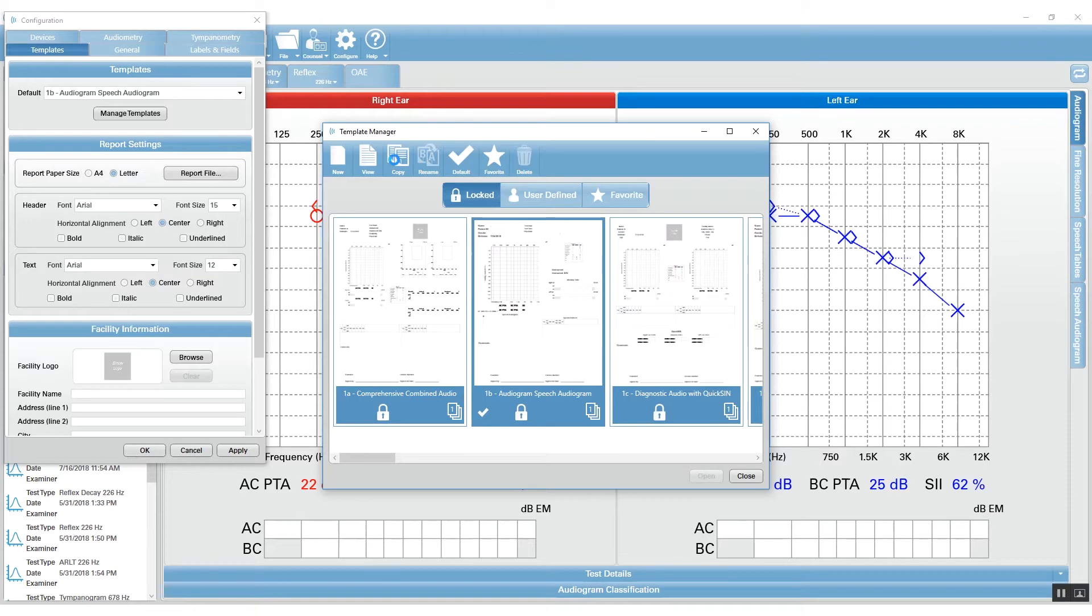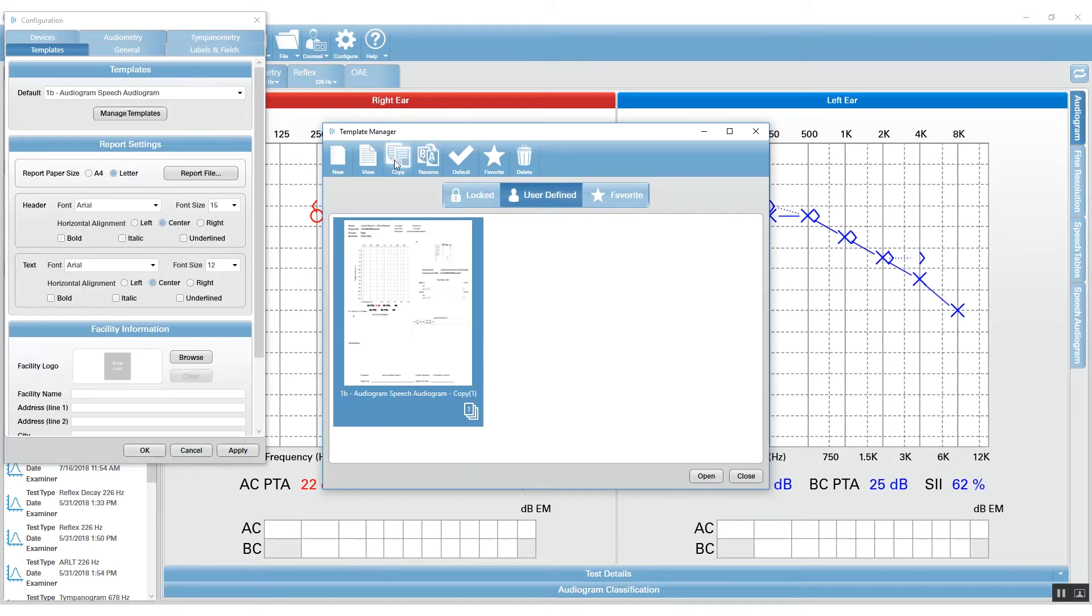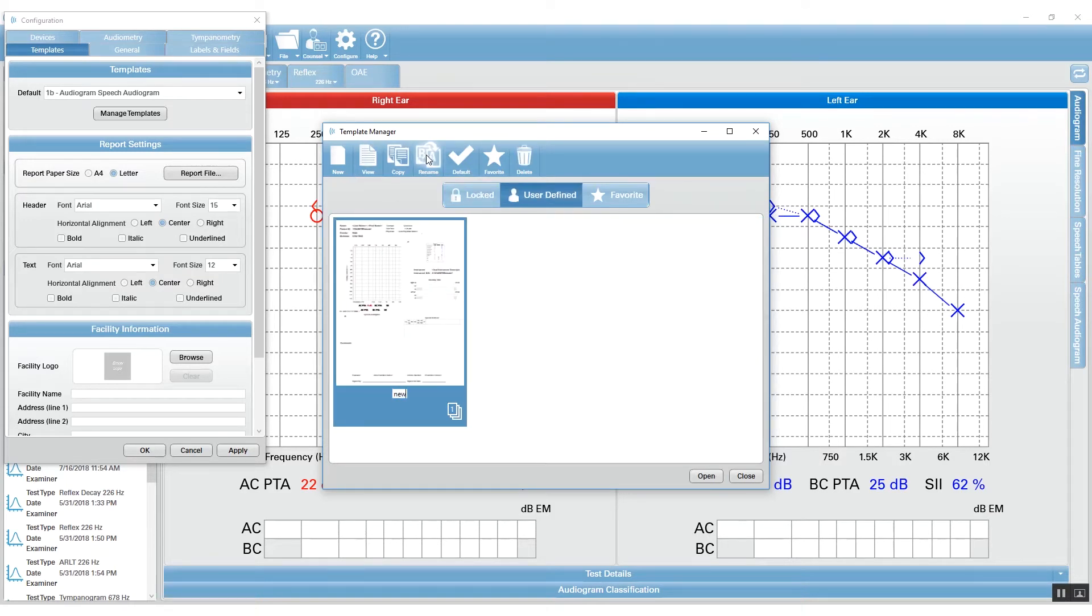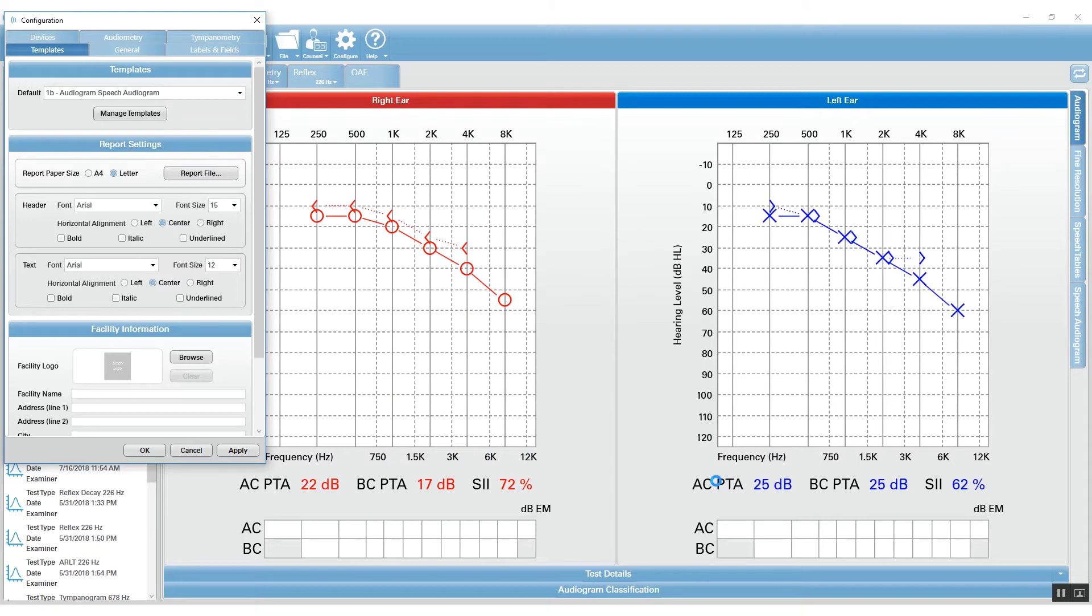When you press Copy, it will place a copy of that report which you can immediately rename. Then you can open that report, which will open the Template Editor.